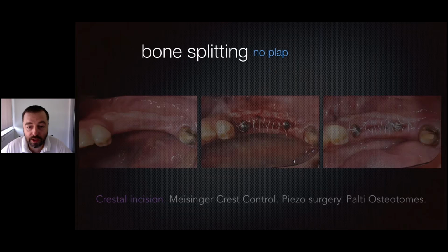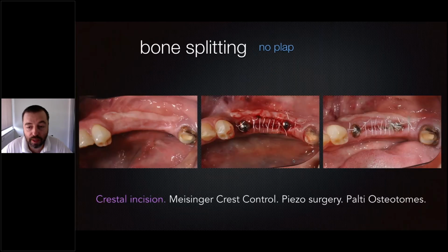Again, a similar case, just to go again through the tape. Just an incision on the ridge, then the enlargement from the interior, as you saw, and here is the final outcome. For this case, we were referred by another doctor who wanted to have a very nice outcome of the volume of the ridge.